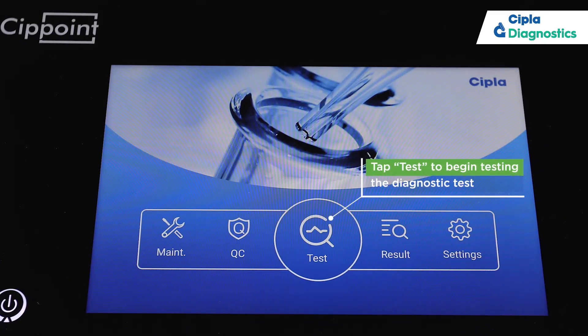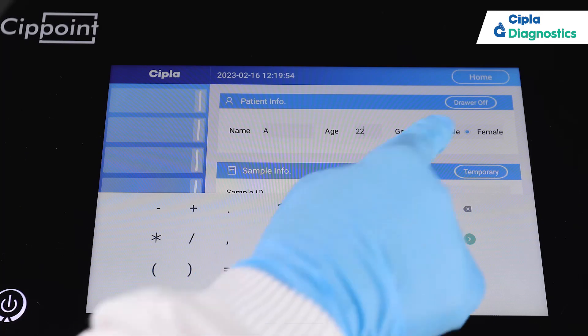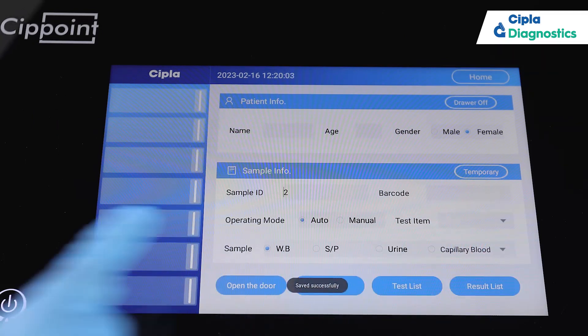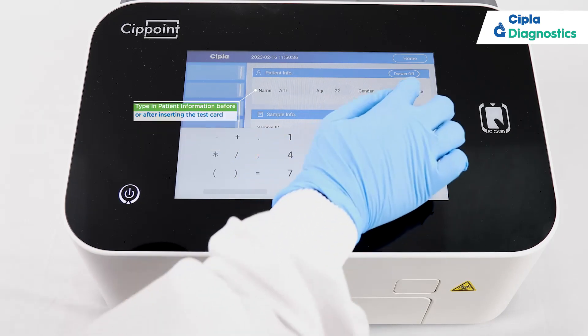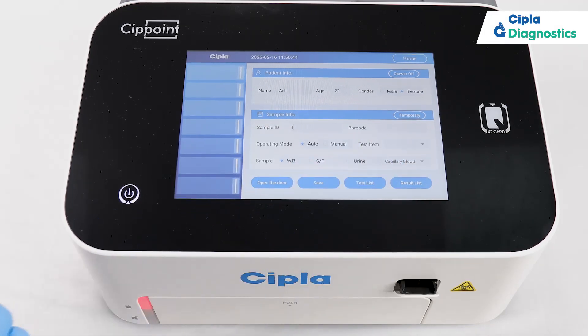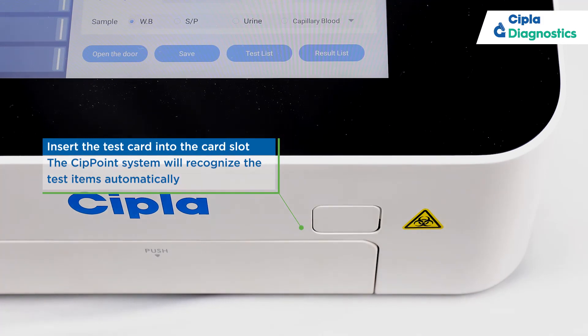Tap Test to begin testing the diagnostic test. Select the sample type you will use. Type in patient information before or after inserting the test card.